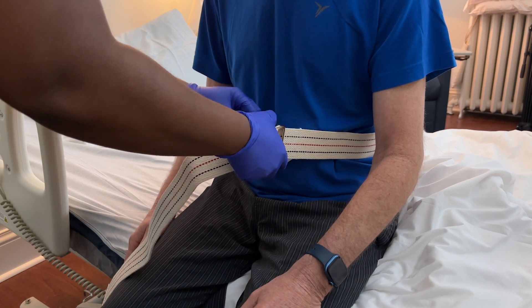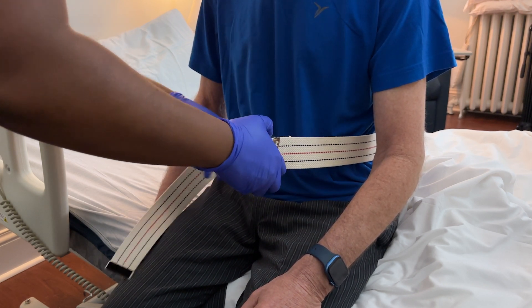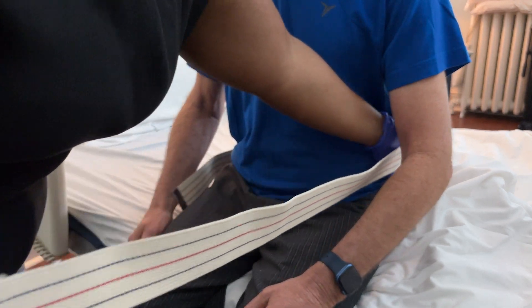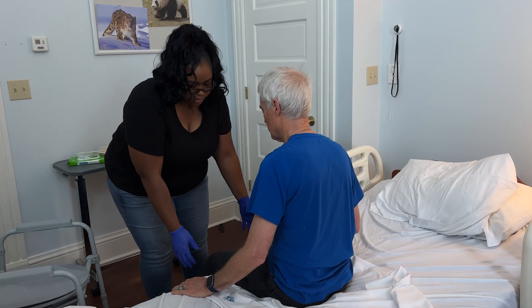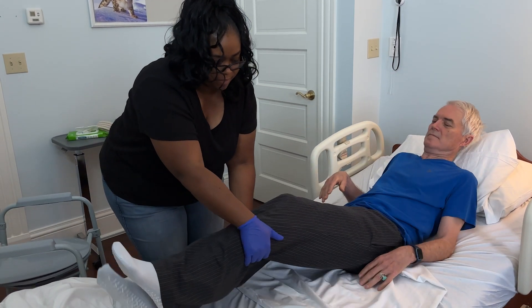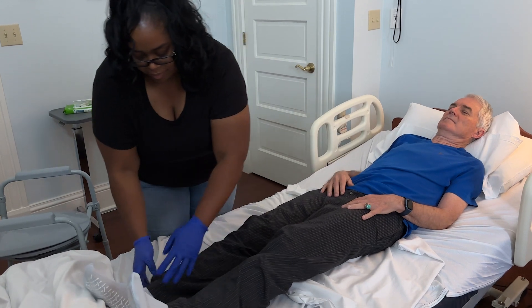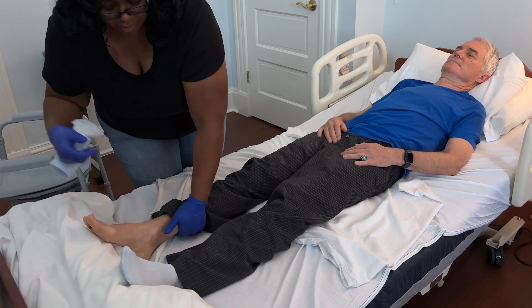This could be uncomfortable. Once your loved one is back in bed, remove the gait belt and socks or slippers. If your loved one can lay down independently, ask them to do so. If they need assistance, have them lay back as you bend over with your knees bent and swing their legs back into the bed. Now that your loved one is back in bed, ensure they are comfortable. Reposition as needed.